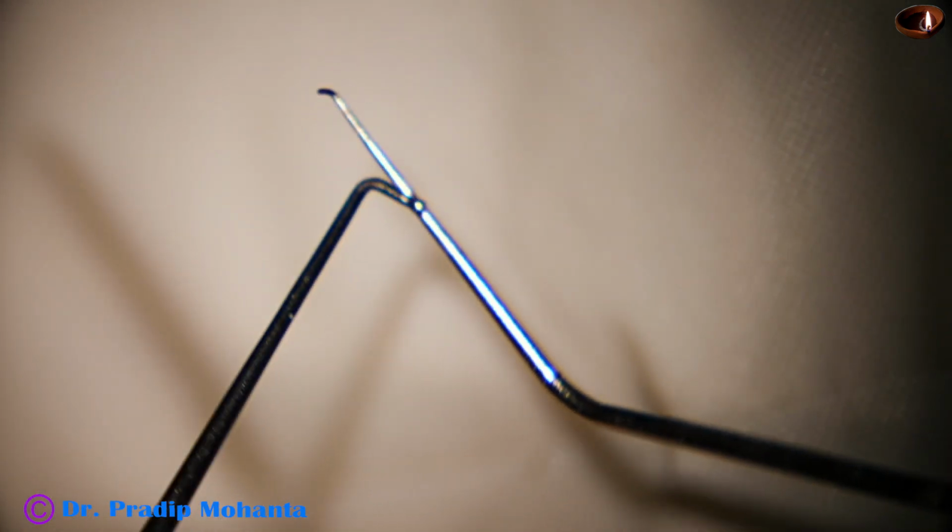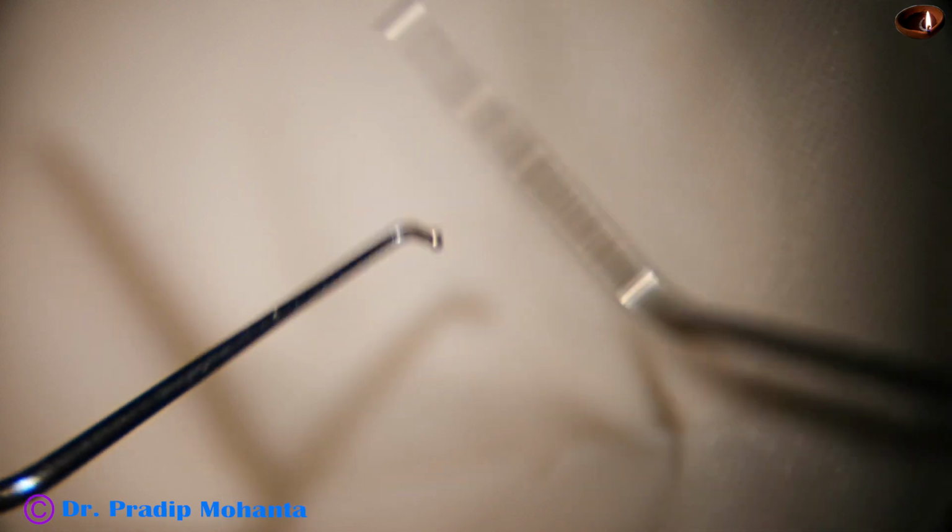The leading edge is sharp, the rear edge is blunt. This is the Mohanta's Prechopper. Tip length is 1.8 millimeter. And now the sustainer. The sustainer, the tip length is 1.7 millimeter. It is round bodied and it has a small ball at the tip.